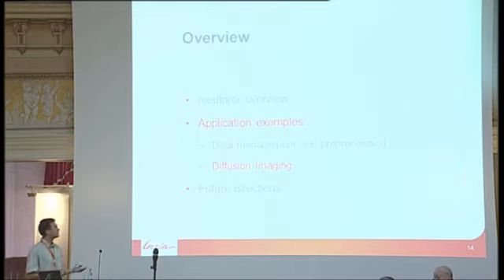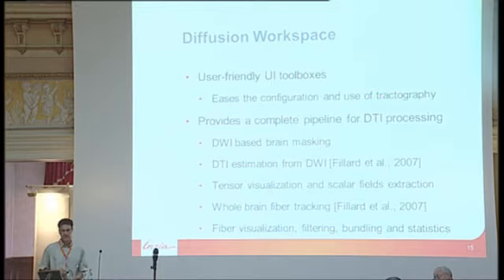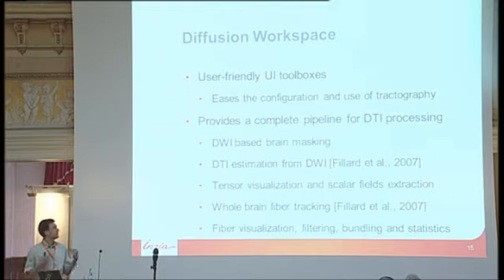So that was pre-processing. Now going on to the really nicer part in terms of screenshots is diffusion. So we have, for the diffusion workspace, a set of user-friendly UI toolboxes that really have the goal to ease the configuration and the use of tractography.